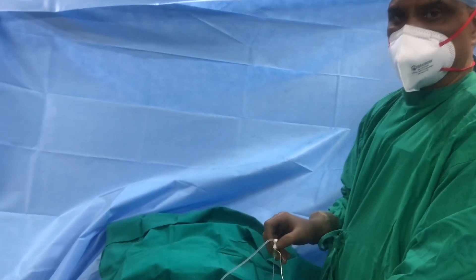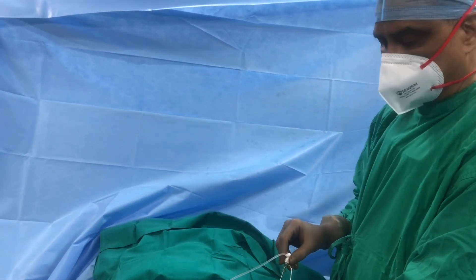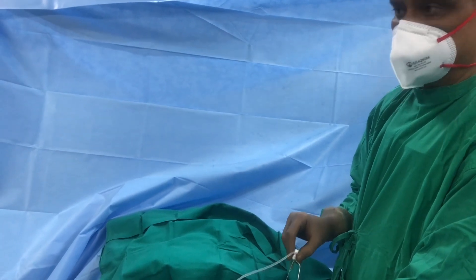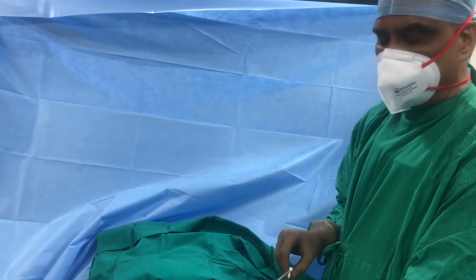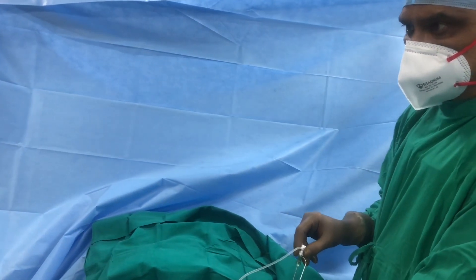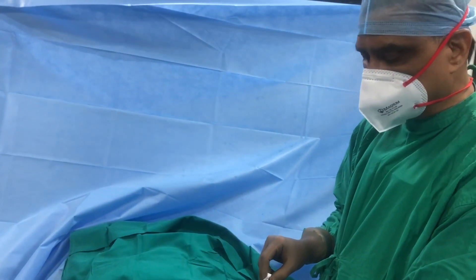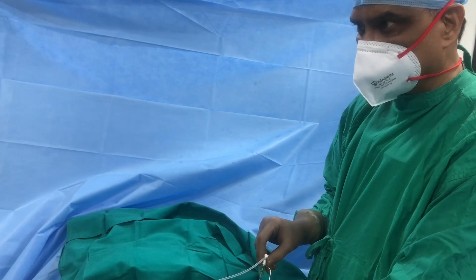A lot of beginners struggle with needle visualization, and it's a long curve to learn to actually visualize the entire length of the needle while doing a USG-guided block. Today we will see some of the tricks that you can use to improve needle visualization. Right now we are giving an adductor canal block.